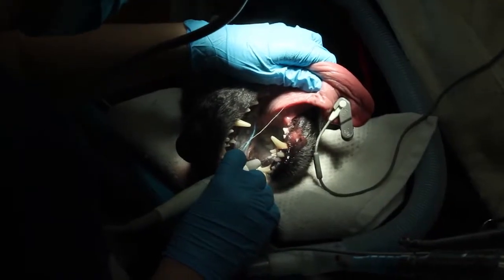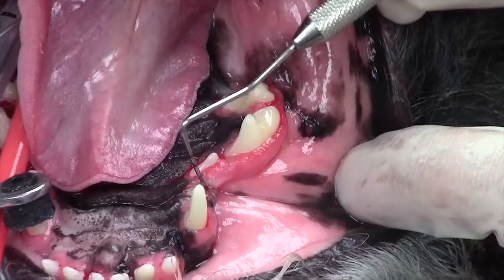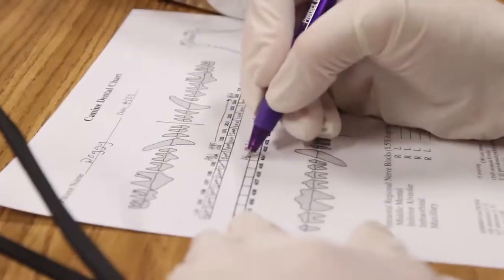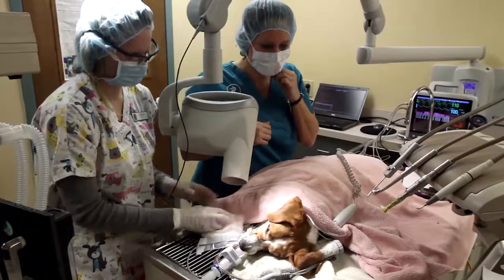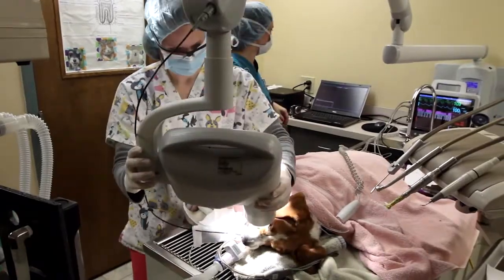So as part of their clinical training for the day, the veterinary technician specialist is going to teach the technicians how to do supragingival and subgingival scaling and polishing, how to probe around each tooth, how to complete the dentistry chart, and how to take full mouth radiographs for every single patient in a timely and efficient manner.